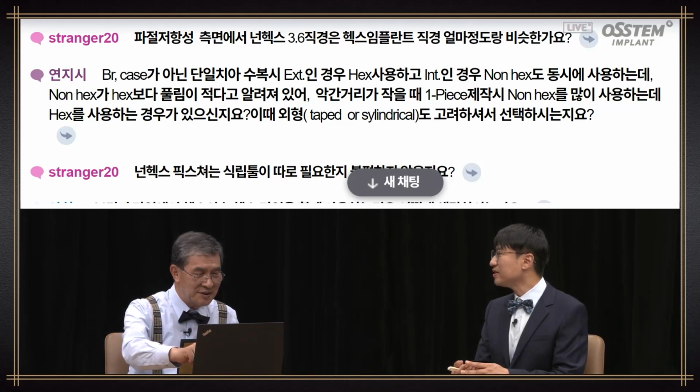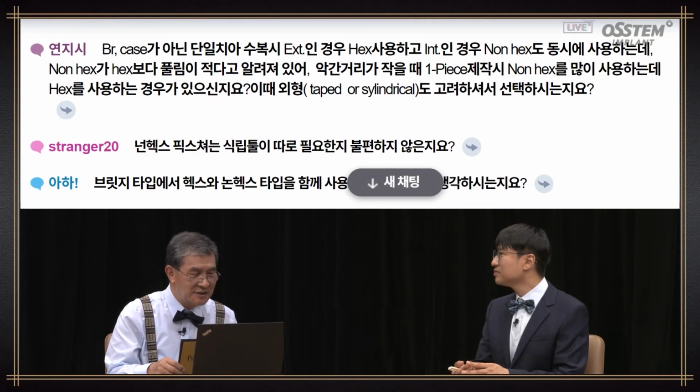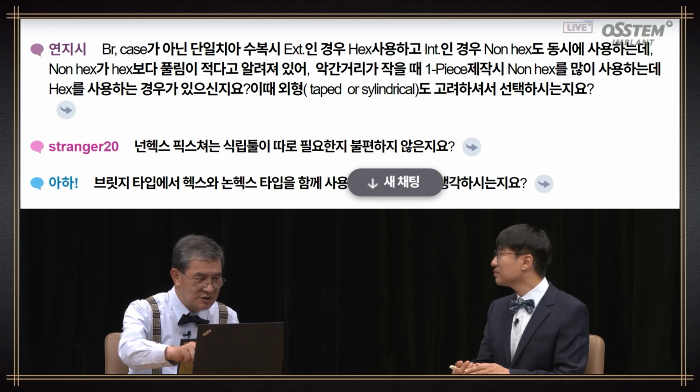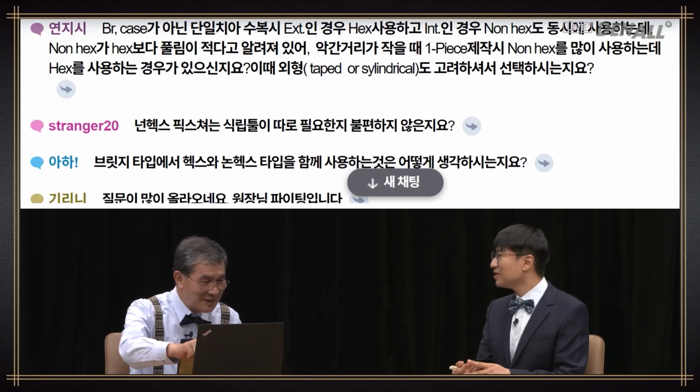Okay, I'm going to just read some questions because of time constraint. In a single restoration case and not a bridge case, in the case of external type, I use hex, and in the case of internal type, I use non-hex at the same time. Non-hex is known to have less screw loosening compared to hex. If the inter-arch distance is tight, in fabricating one piece, I've used a lot of non-hex abutments. Do you have experience using hex? Do you make the decision factoring in the contour? I'm just reading the questions out loud. You need to select the best question.